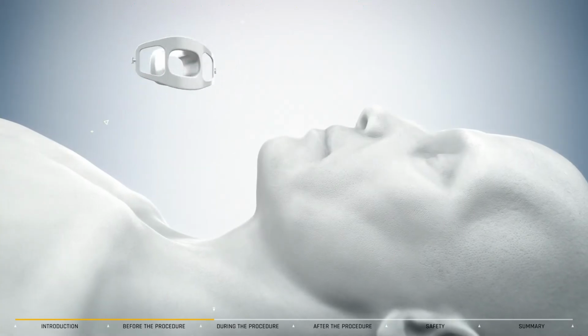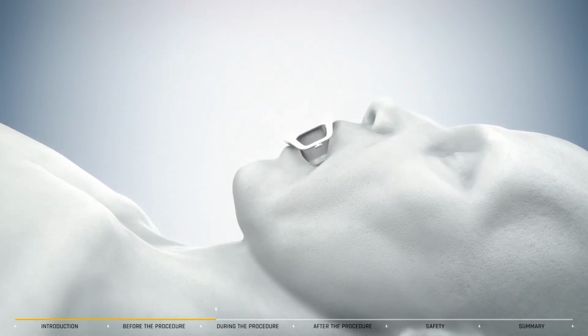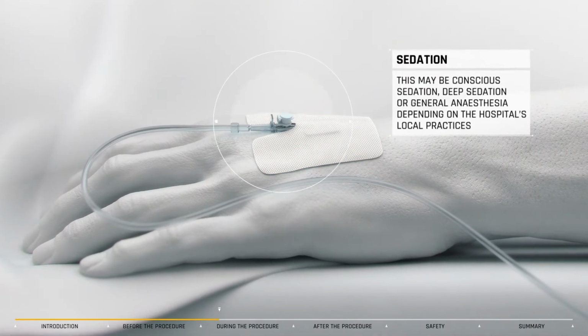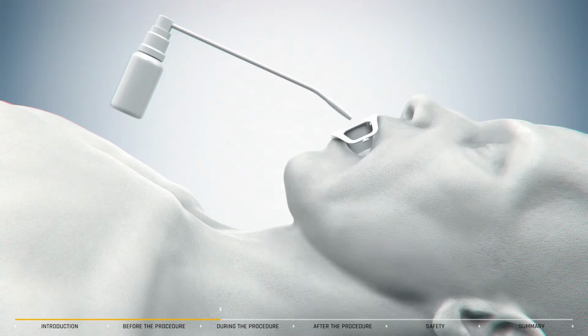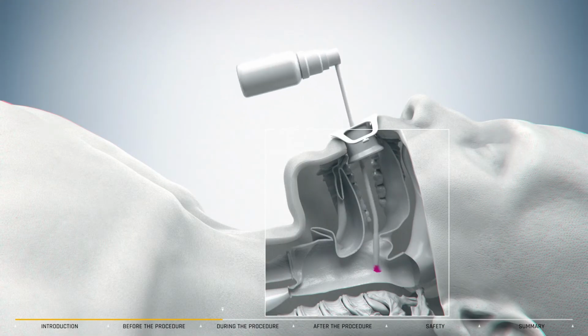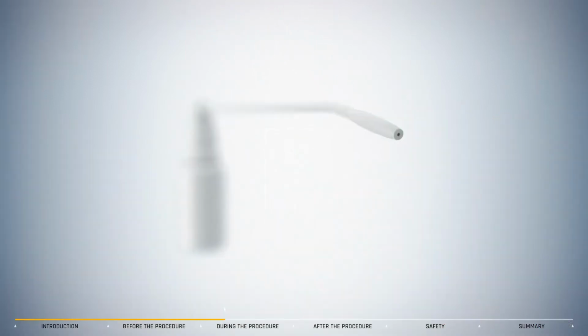A mouth guard is placed between the teeth to keep your mouth a little open while you are sleepy and also protects your teeth. Just before the procedure, you will be given a sedative by injection into a vein to keep you comfortable. If local anesthesia is used, a gentle spray to the back of the throat will make the throat numb, which will minimize coughing and discomfort. This spray can taste of bitter bananas.